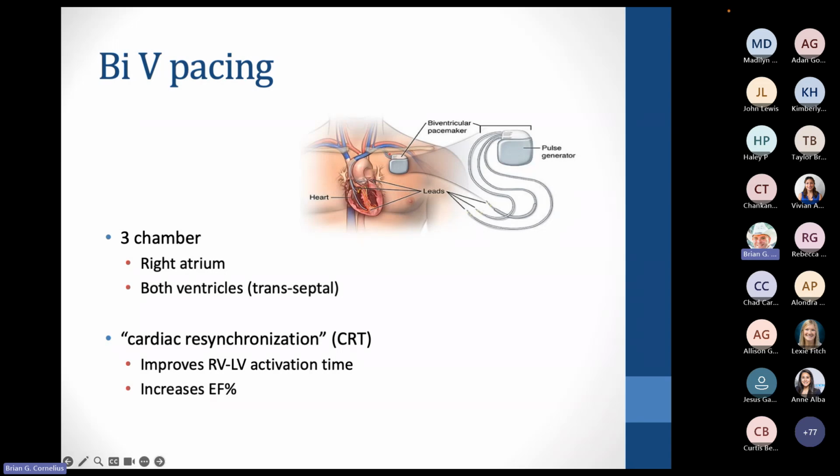The other thing that we get involved with is the actual placement of these devices. There are a couple of different ways you can do the anesthetic for putting in a pacemaker. You can put the patient under general anesthesia, which is always a default. But a lot of times, just because they're so sick, we'll do sedation and a local. Sometimes we'll do a periclavicular block, sometimes a cervical plexus block. It really just depends on where they're putting the device in. The surgeon may just infiltrate with local.